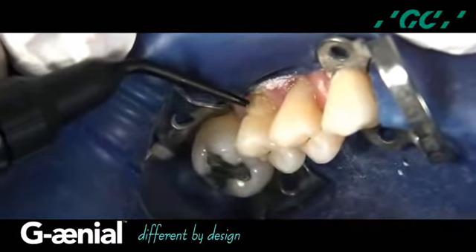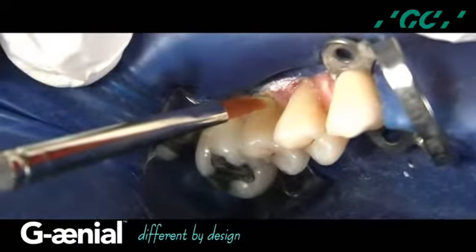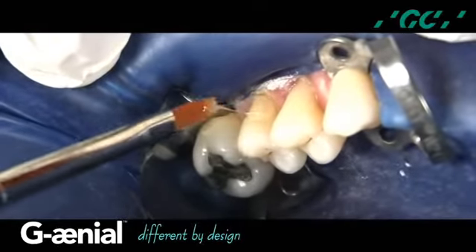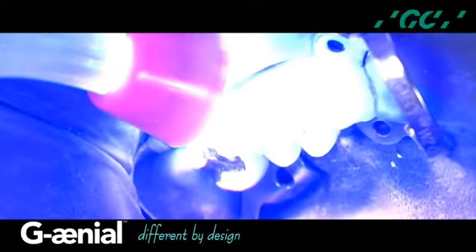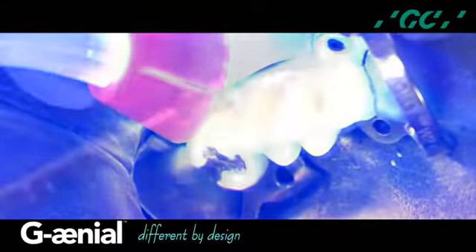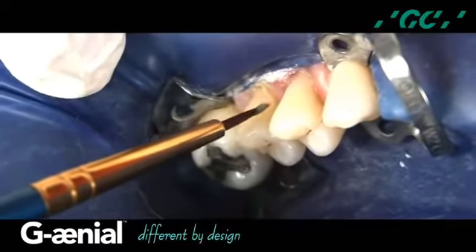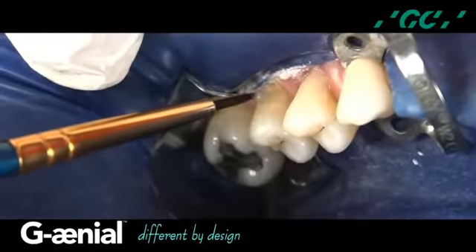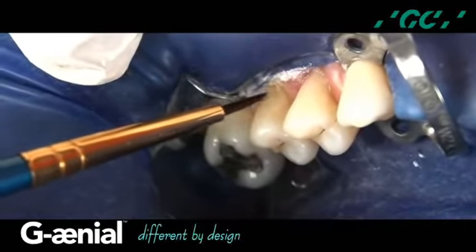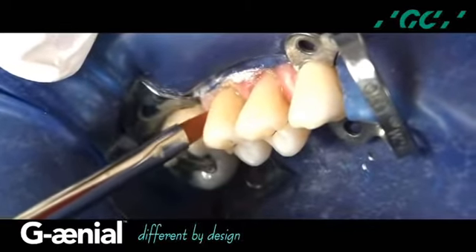Utilizing incremental layering of these next-generation flowables such as Gineo Universal Flow improves marginal integration. Reports by Yamazaki, Chi, and Felix indicate that the use of an incremental layering technique resulted in significantly less microleakage compared to the bulk technique, indicating this layering technique is effective in improving marginal sealing at the interface. By anticipating the required artificial enamel dimension when developing the artificial dentin layer, a final artificial enamel layer of AE shaded Gineo Universal Flow can be integrated to achieve an optimal anatomical emergence form and color. A small amount of composite primer by GC on the tip of the brush facilitates adapting and smoothing the flowable material while developing the emergence contour, and also improves the smoothness of the restorations before light curing for 10 seconds.